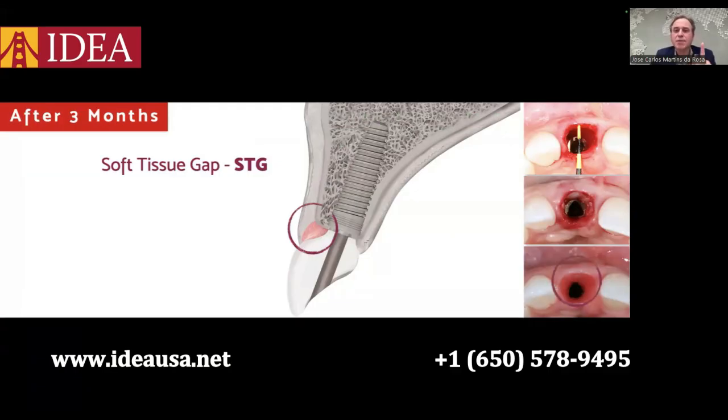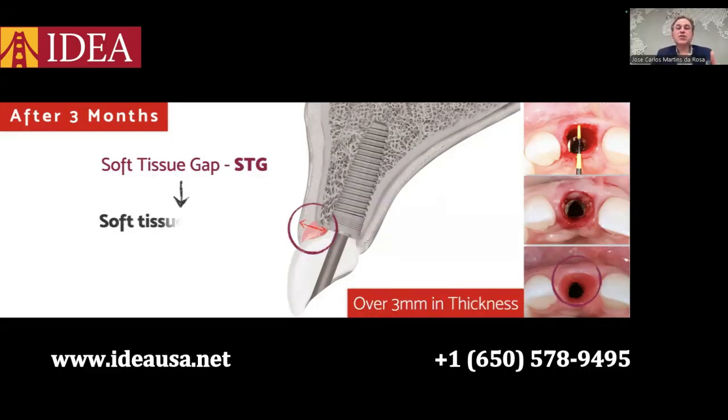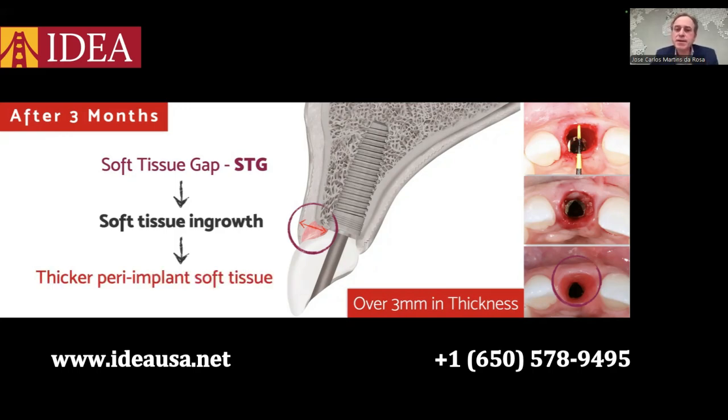This soft tissue gap that we left intentionally, we are going to obtain over 3 millimeters in gingival thickness after 3 or 4 months, and along the months and along the years as well. So this gap was left for soft tissue ingrowth, and for sure the main reason was to obtain a thicker peri-implant soft tissue.